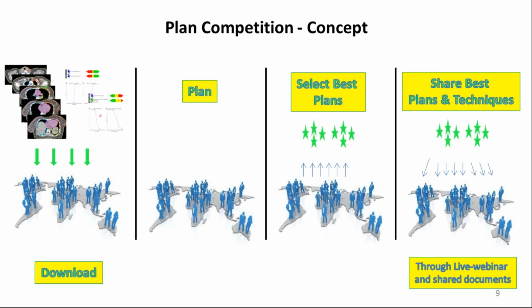After the best plans are selected, as in our case today, for example, today's Pinnacle live webinar, the top plans selected, the best practice or the best strategies for the Pinnacle treatment planning system will be explained today by our panelists. The knowledge will be shared through a live webinar as well as shared documents. In these shared documents, we will be compiling questions and answers as well as the recommendations from the top planners, and we will compile them at the end of this competition.